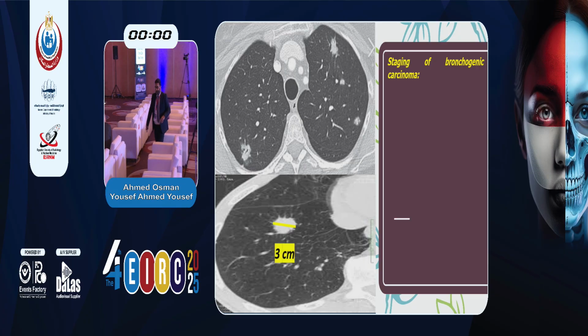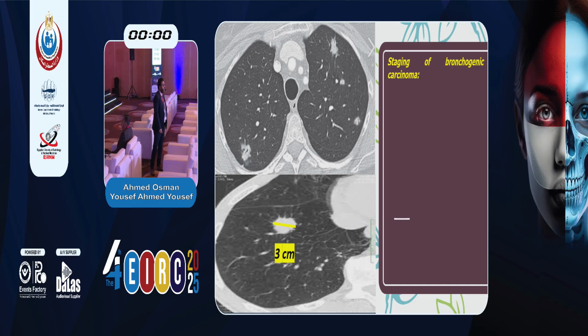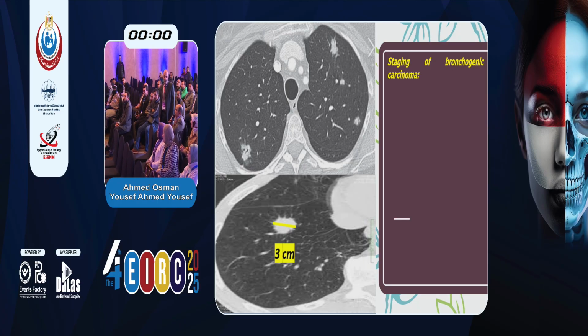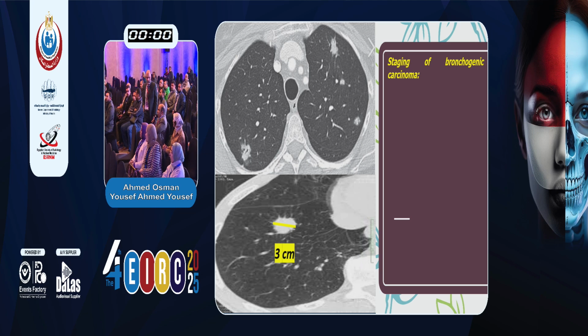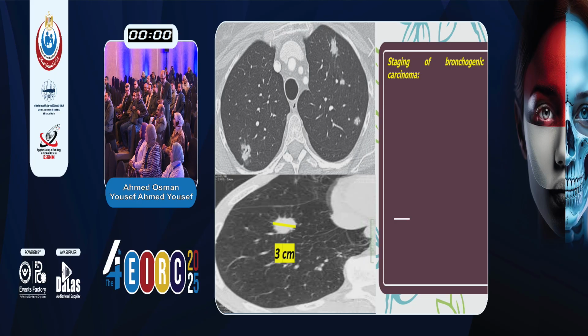Thank you. I have a question here. We see it a lot: either bronchogenic cancer, breast cancer primary, or even unknown primary. I see some nodule, and they ask me, is it a special nodule? Is it metastatic, or just inflammatory? Do we have tips and tricks other than follow-up to differentiate between these two? And is there a cutoff size to further go for PET?